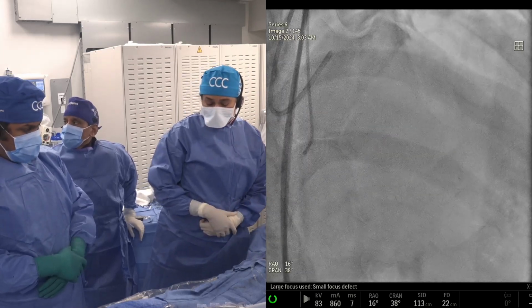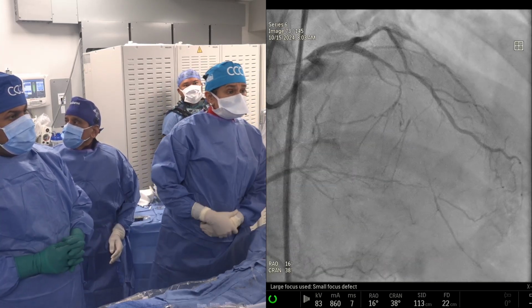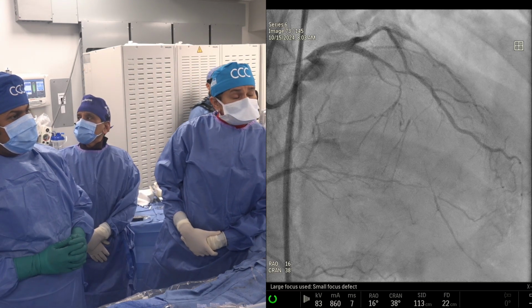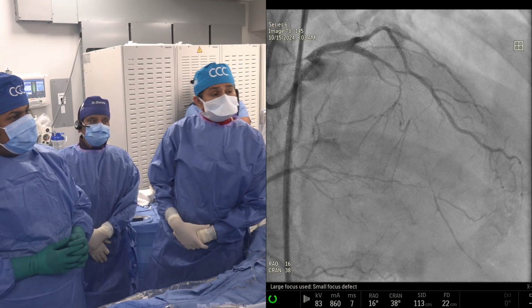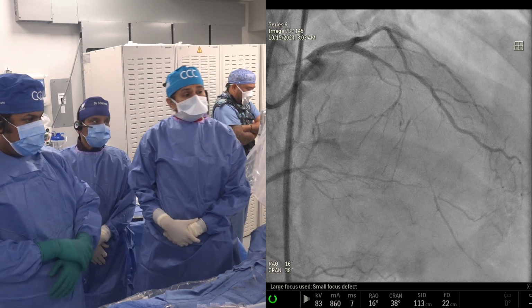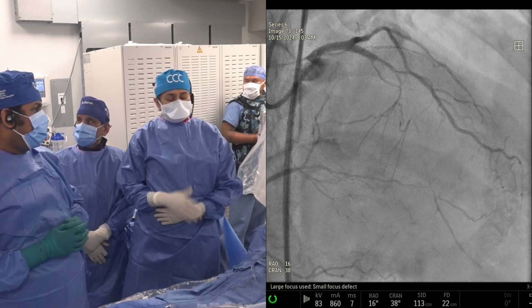Anu, my observation is this may turn out to be extremely challenging, or it may be straightforward. So if it is straightforward, could one make an argument that, look, let's just give it a quick shot first with the wire before getting a contralateral, or is it absolutely mandatory and does it make complete sense to first have a contralateral? Yeah, because if you just do a single picture of the LAD, which we don't have here but we had in diagnostic, you could not see the distal LAD.